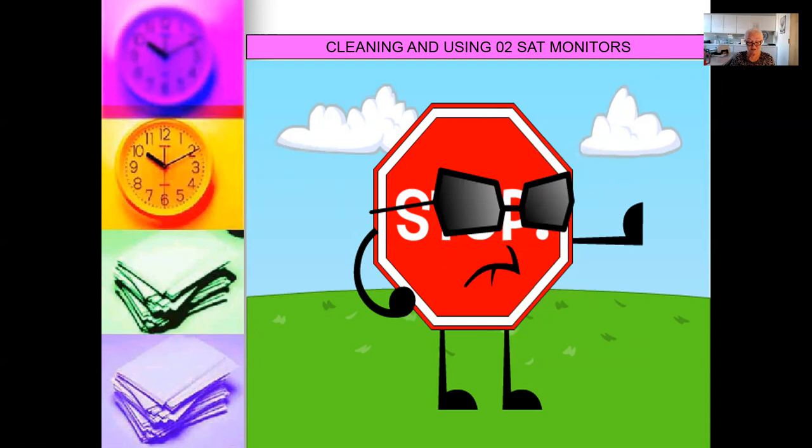When the battery indicator indicates that the battery is low, we need to replace the batteries at that time. Keep your pulse oximeter in a dry environment. A moist environment can damage the oximeter, rendering it useless.